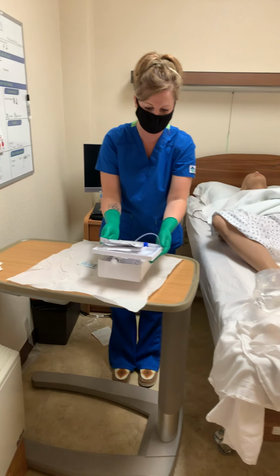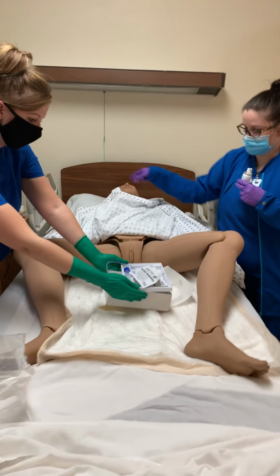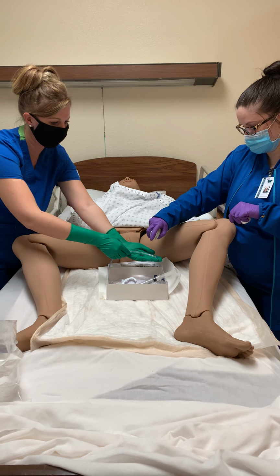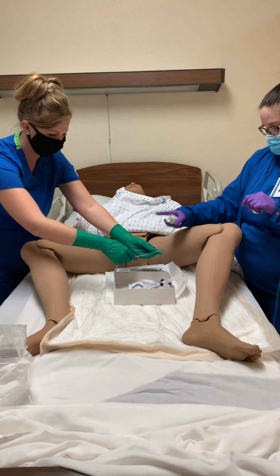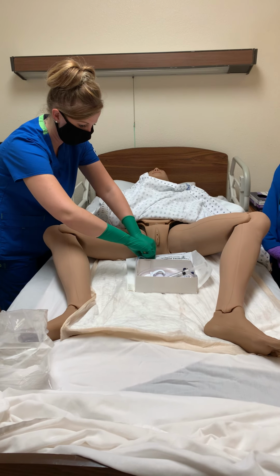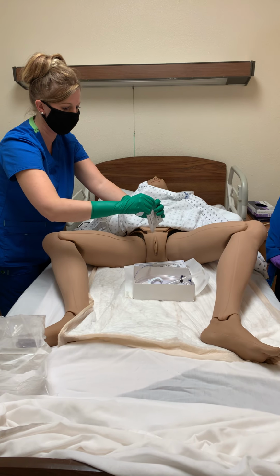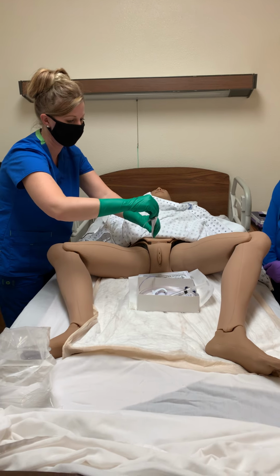I would ask my assistant to uncover. Joanne. Thank you. Keep the sterility here. Perfect, and then she's going to put lube on the end there. Perfect. Okay, Joanne, I'm going to put some iodine on the outside of your labial folds, and then I'm going to work my way outside, outside, in.